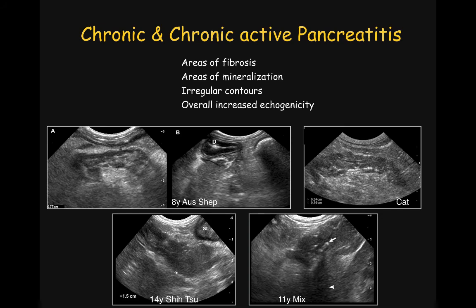Diagnosis of chronic or chronic active pancreatitis cannot be obtained based only on ultrasonographic features. However, several ultrasonographic features may be useful: areas of fibrosis, mineralization, irregular contour of the pancreas, and patchy or overall diffuse increase in echogenicity of the pancreatic tissue. In this first case of an 8-year-old Australian Shepherd, we see longitudinal and transverse sonograms of the right pancreatic lobe. The descending duodenum in cross-section indicates we are on the right side, and the pancreas is actually within normal limits for size at about 7.7 mm. However, we see changes in echogenicity.